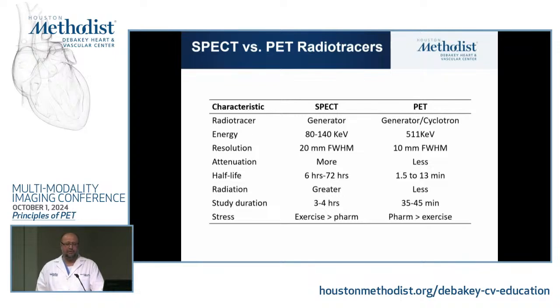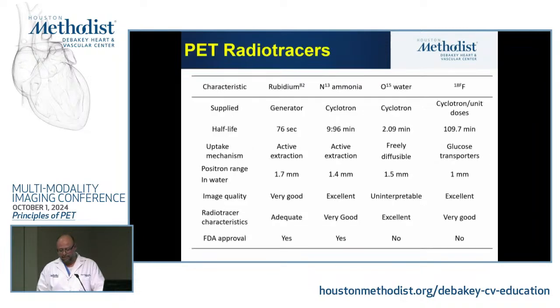At this moment, until last Friday, we did not have a pharmacologic agent where we can do stress testing with exercise for PET, but I'll tell you what changed last Friday. Before, you could do either exercise or pharmacologic stress with SPECT, but with PET you can only do pharmacologic stress because of the very short half-life.